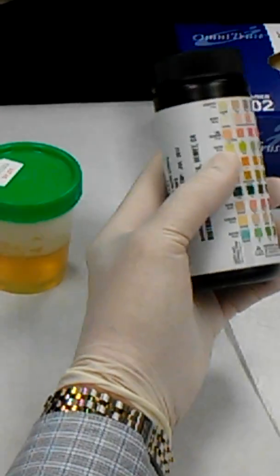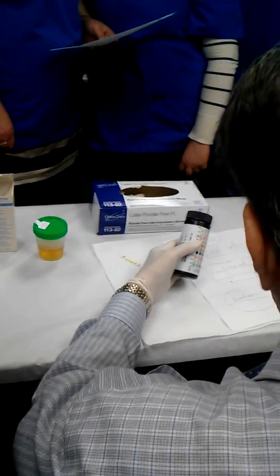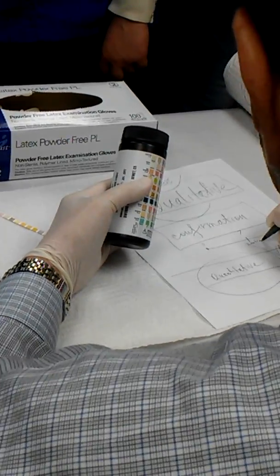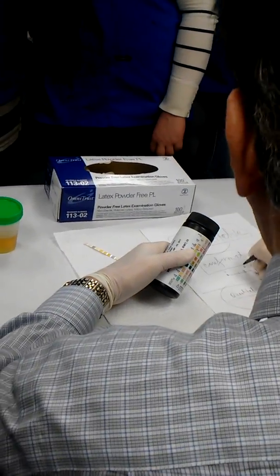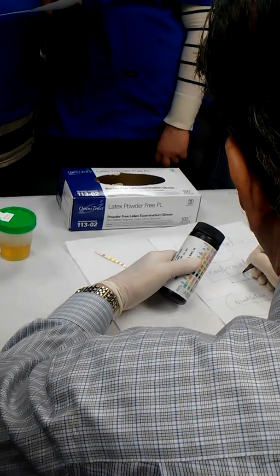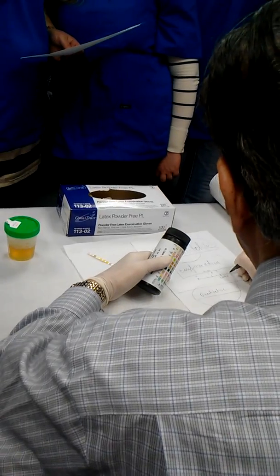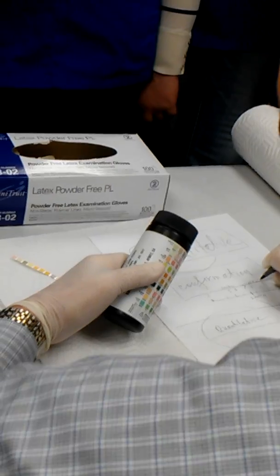Now, pH. What is pH? pH could be from 0 to 14. If it's in the middle, 7, it's neutral. It means the urine is neutral. If it's 6, 5, and 4, it's acidic. So acid in the urine. If it's 8, 9, and 10, it's alkaline. So alkaline urine. Okay, and 7 is neutral.